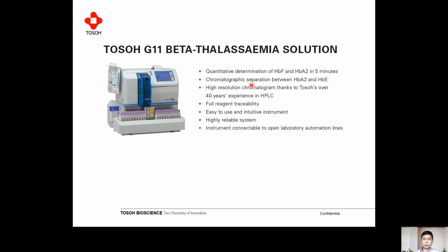So we have over 40 years of experience in HPLC with full reagent traceability, easy to use, reliable, and we can connect to an open lab automation line.